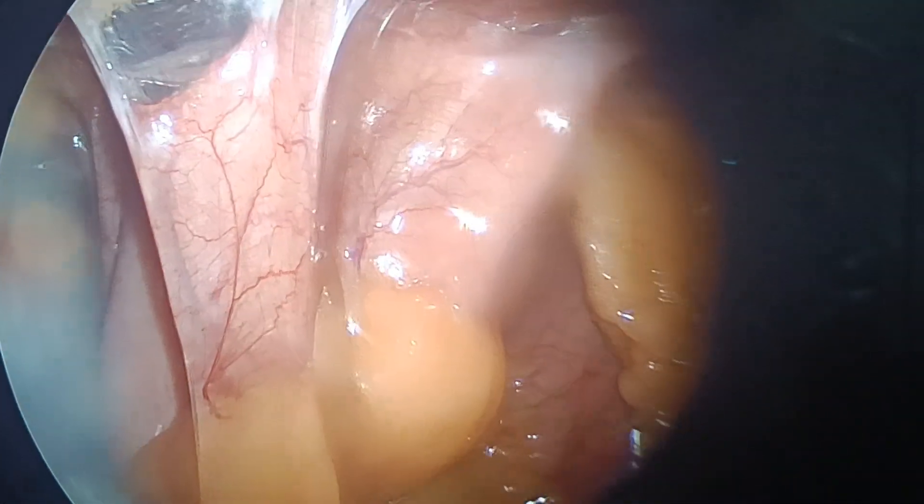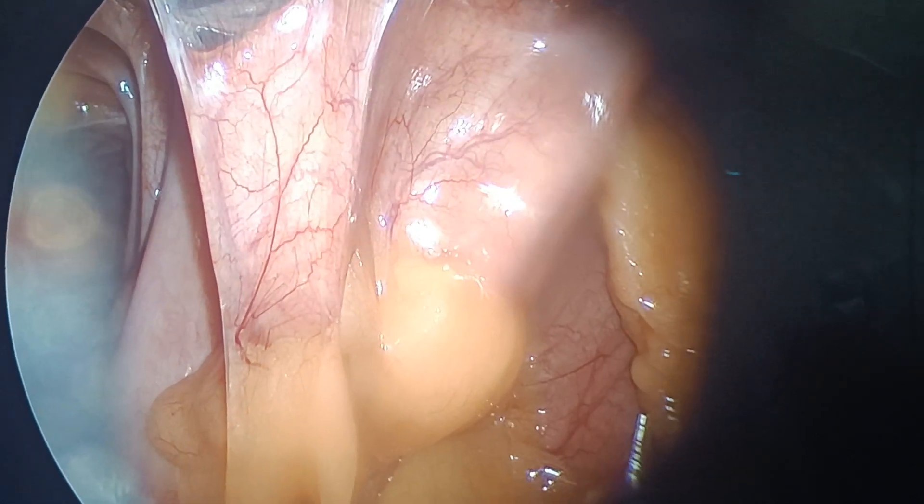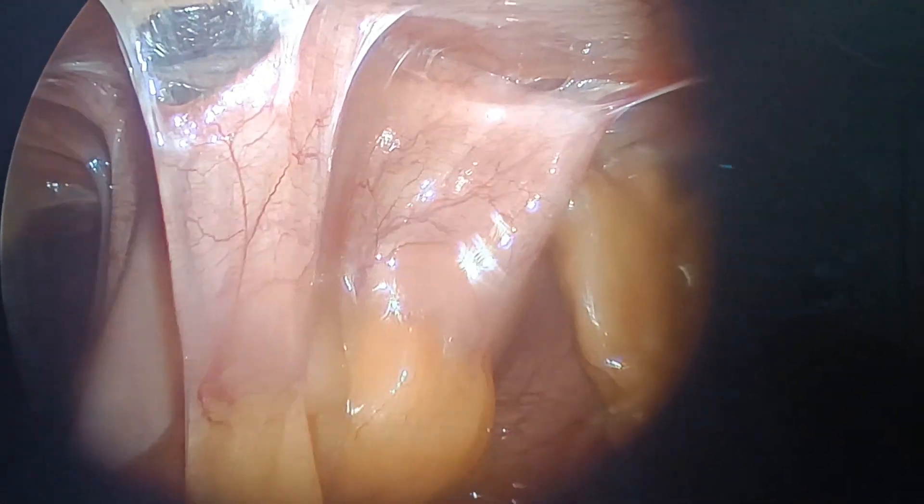Hello, I am Dr. Aviral. This patient is having bilateral inguinal hernia and I am doing bilateral TAPP. The interesting part is this patient has a prior surgical history.